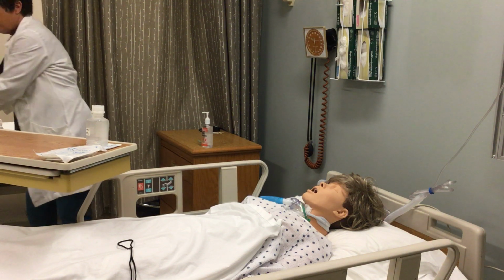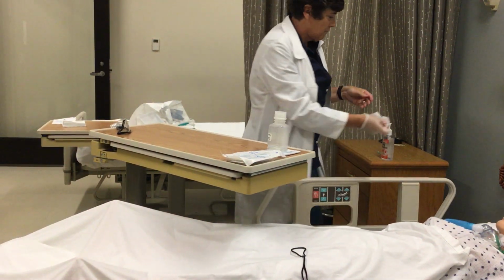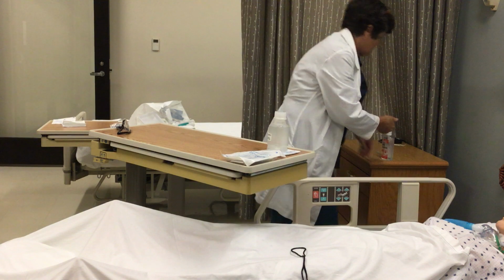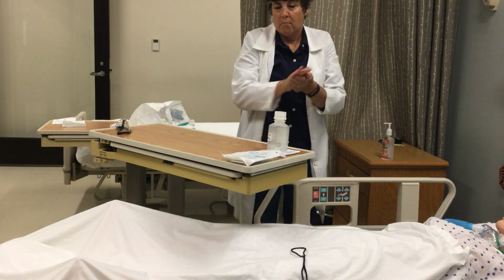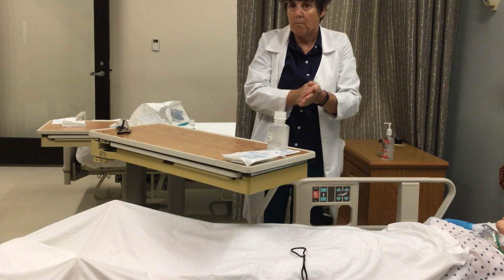Dispose of all that. Document and report the patient's response and expected or unexpected outcomes.